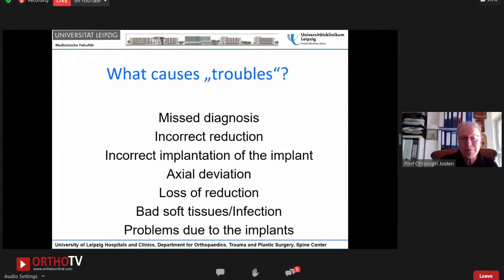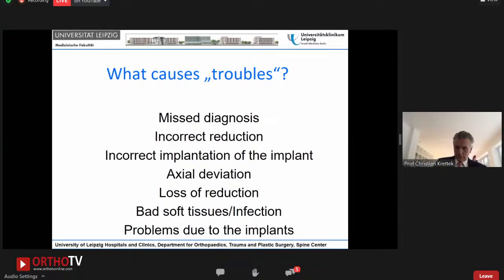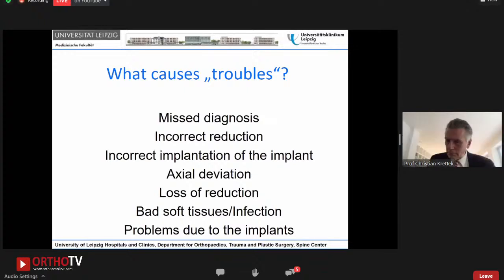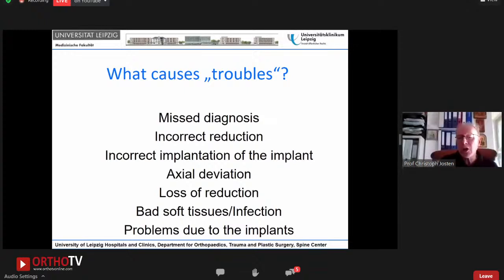10 months follow-up. Yes, we have to put the question, what causes trouble? Of course, misdiagnosis, incorrect reduction. Christian Krettek showed you an excellent presentation with the tools, how you avoid incorrect reduction. But beside the soft tissues, you have the problems due to the implants. So the correct choosing of the implants is crucial. The less optimal the implant you are choosing, the more you need an additional plate osteosynthesis.